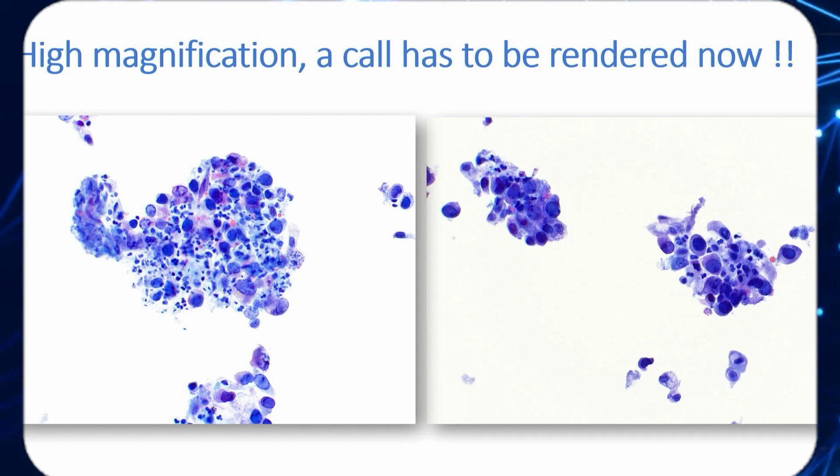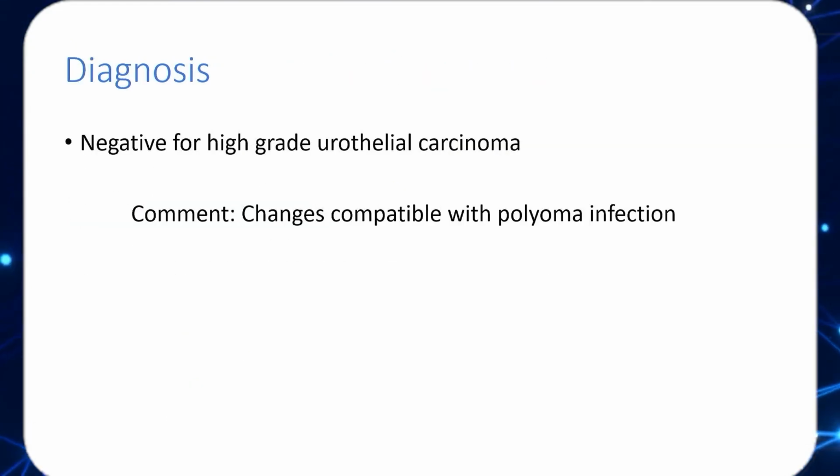So one thing I didn't mention was the nuclear membranes. Take a look at this carefully here. Nice and round. And this is a real case. I mean, this was from last month. And I was a little stumped as well what to do with this. But again, the more you look at it, and this is the final diagnosis, polyoma infection.